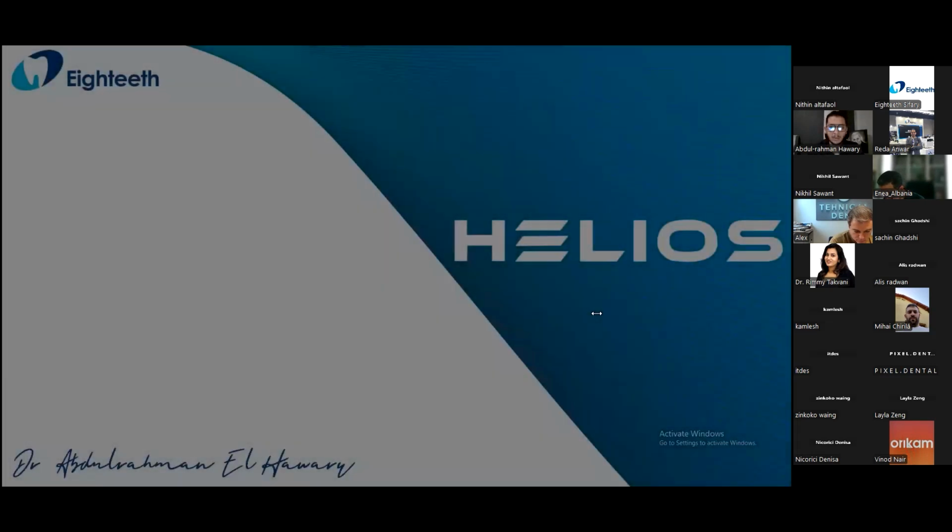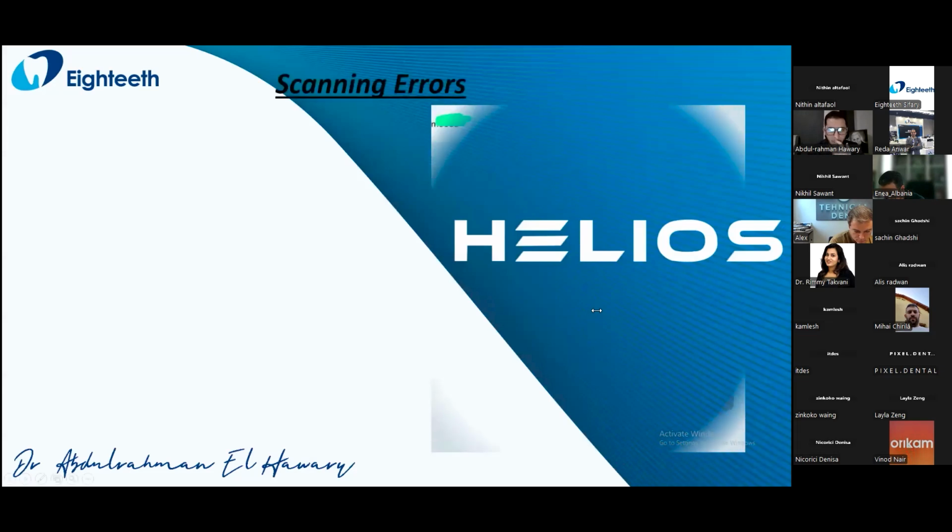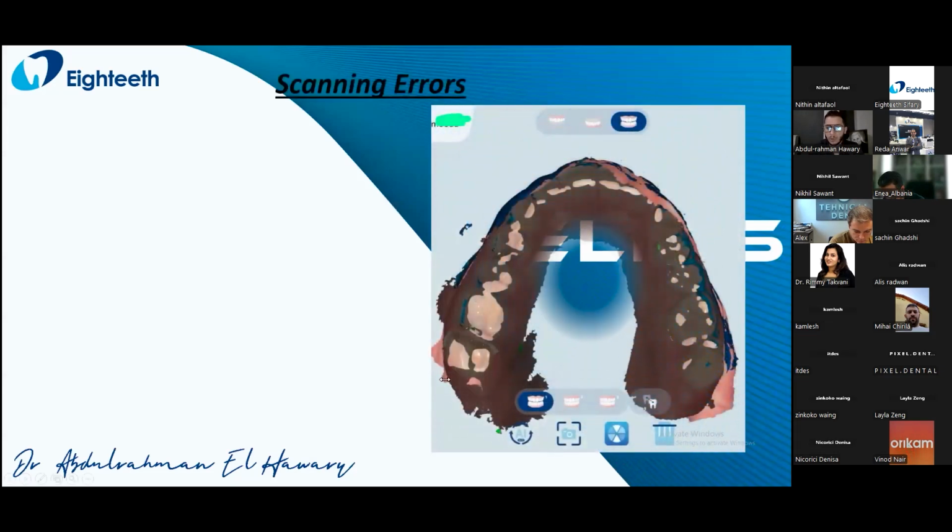So actually this is part of the scanning errors. This is a huge scanning error. This bite will 100% be inaccurate, and 100% the restoration will come with irregular dimensions and incorrect occlusal dimensions, because we have too many intersections.